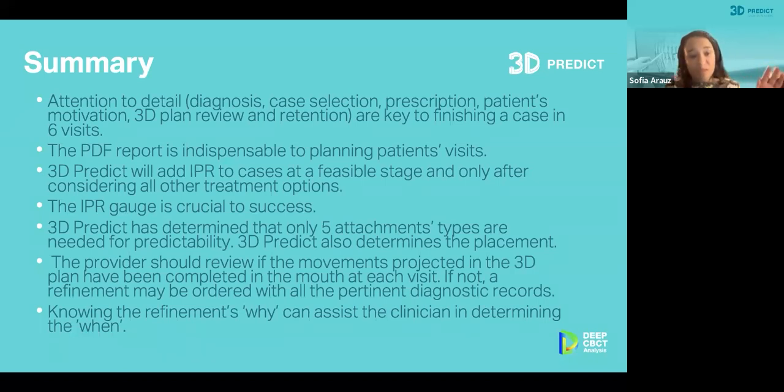Like I said, because we're very minimalistic, you as a provider should review the movements projected in the 3D plan that have been completed at every step. Every time you have the patient in the chair, take those pictures, show it to the patient, go to the 3D plan, make sure everything is tracking so you can make the decision of whether a refinement is needed or not needed and when to submit it. And know that the refinements why are gonna take you into the when. So if you know why you need the refinement, you're gonna know when to submit it. Can I wait until the end of the treatment? Do I need to submit it now?